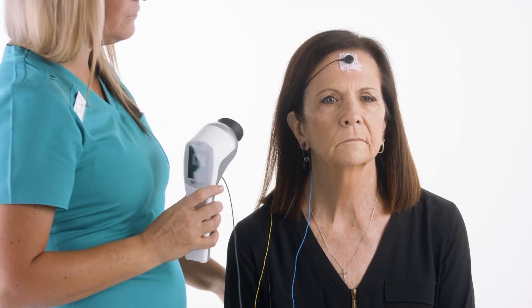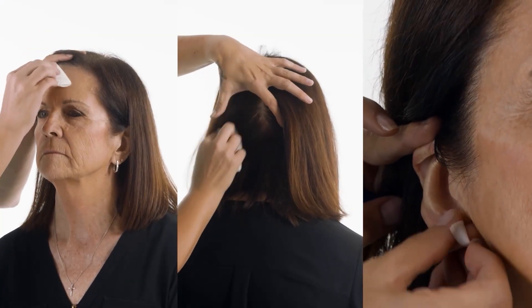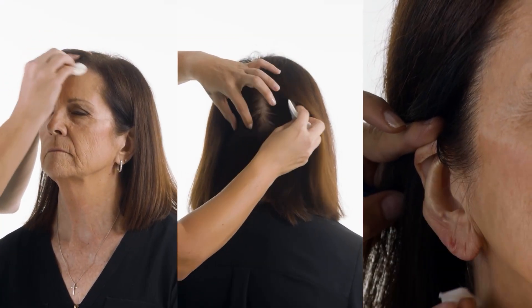You will need to prepare three areas: the forehead and the back of the head with the NuPrep, and the earlobe with an alcohol pad.